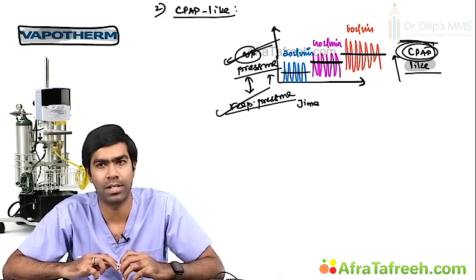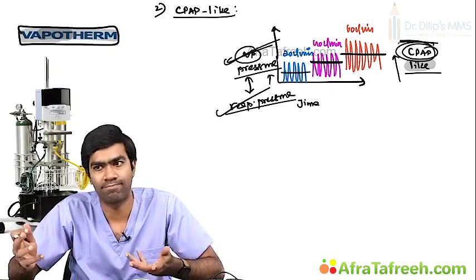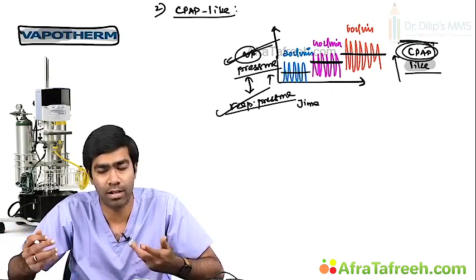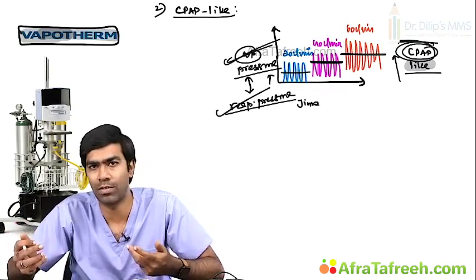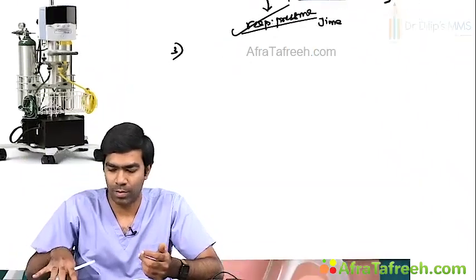That's what is claimed by the companies, and that's been demonstrated in patients with cardiac failure, where it is definitely useful, and it has been proven to open up alveoli also. So that's why these devices are very helpful.